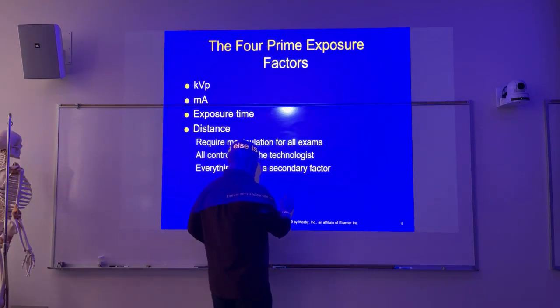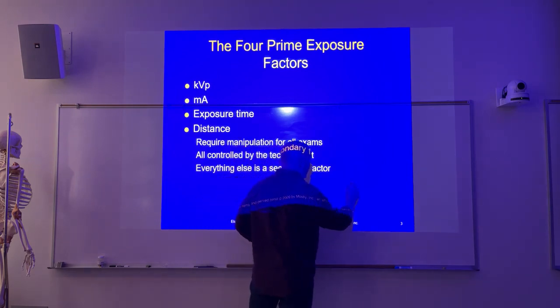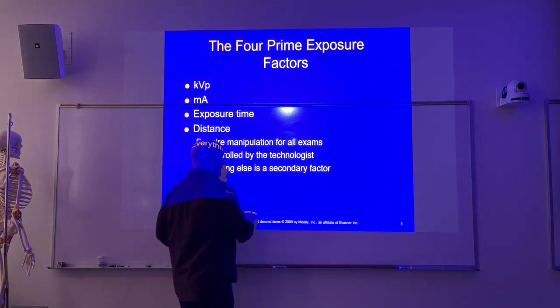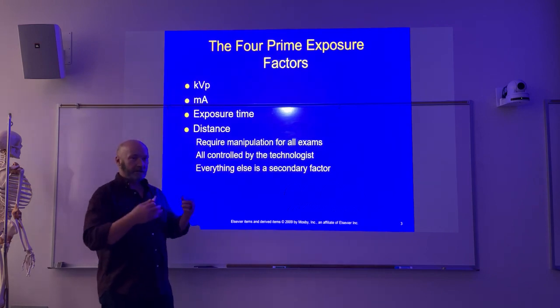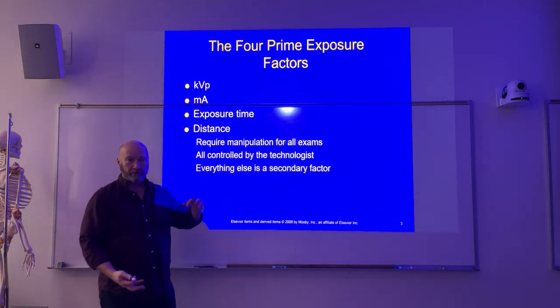Okay. All right, so single phase, remember, we've got a voltage ripple that looks like that, right? And then three-phase, we've got something more like this. It's a lot of pulses. So we've got a lot of individual pulses for three-phase. And what it's talking about is the amount of voltage ripple.